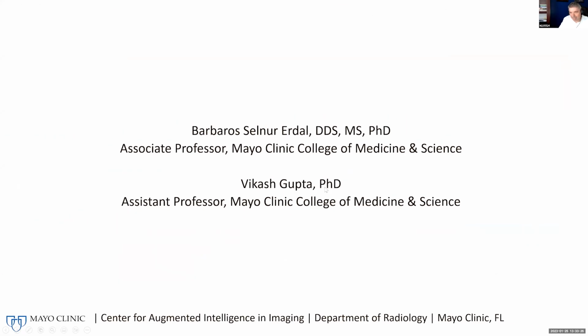So today we'll be talking about the quick overview for MONAI Deploy.